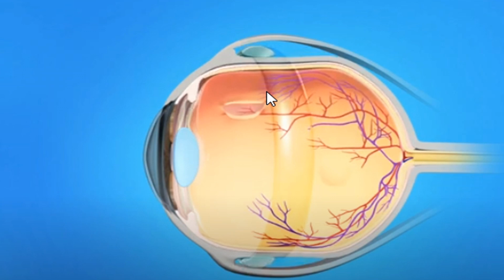In contrary to the other two solutions, which are the vitrectomy to release the pulling force here, or pneumatopexy, that also push this detached retina to its normal place. And if you have a good look here, you will understand all the complications that I've told you about the scleral buckle. You remember? Can you imagine how much ischemia is in here?